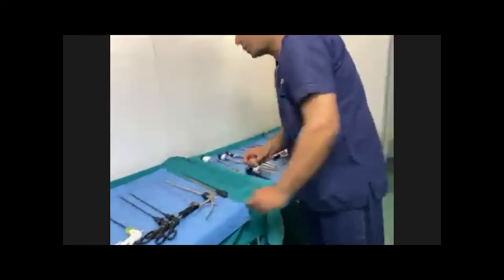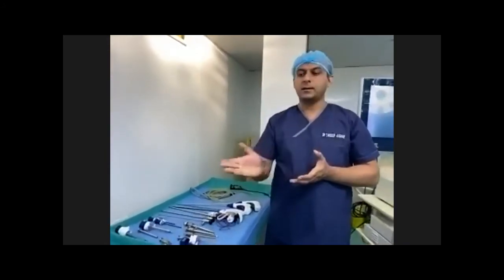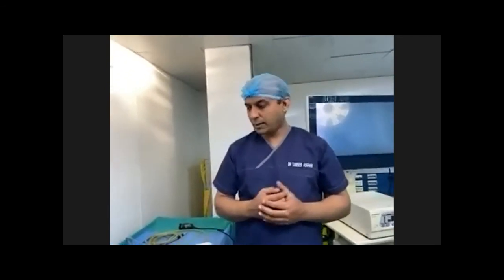So that was a brief description about the ports and about basic laparoscopic instruments. The basic laparoscopic instruments usually are 35 to 37 centimeters in length, and in bariatrics and in obese patients, we use instruments which are around 43 to 45 centimeters in length. The mostly used instruments are 5 or 10 millimeter, but in pediatric surgery, 3 millimeter instruments are also used. If there is any question regarding the instruments or the graspers or anything, please ask.